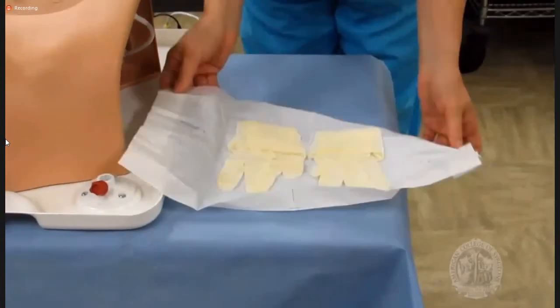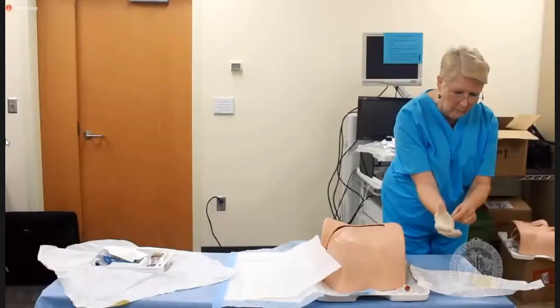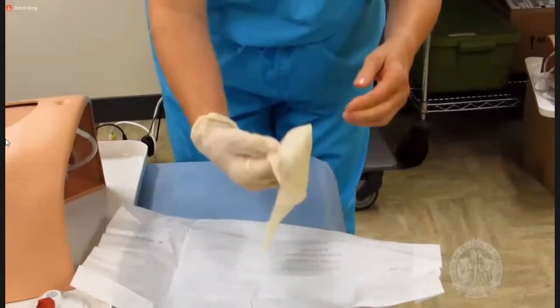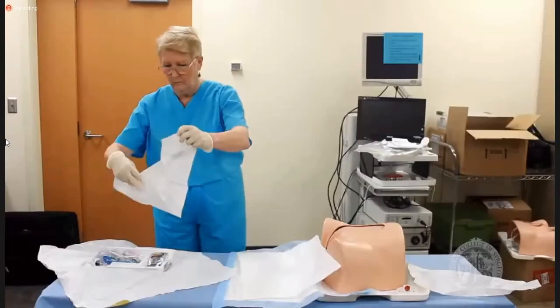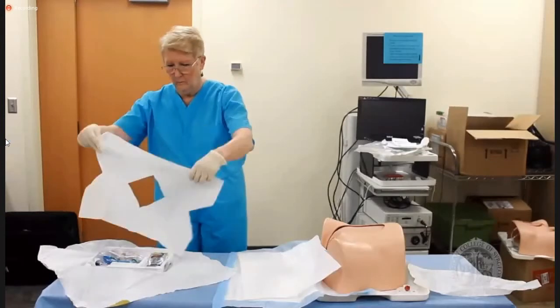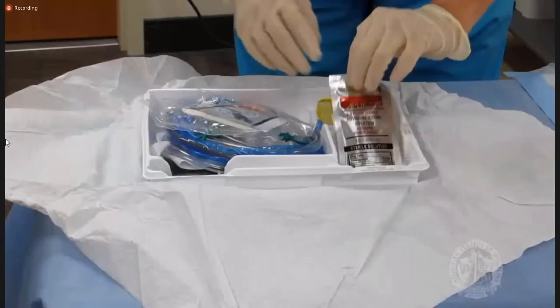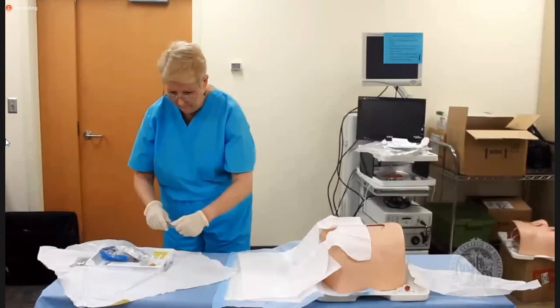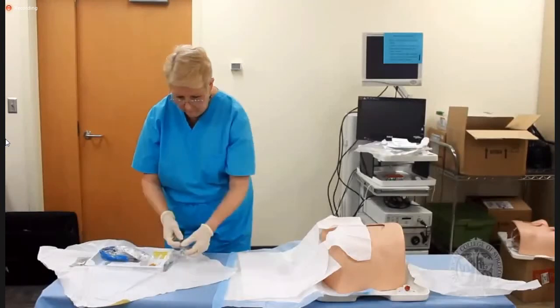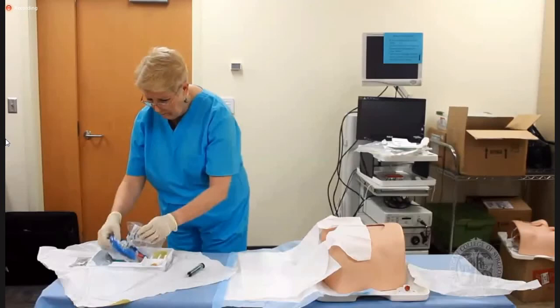Don your sterile gloves like so, making sure you have nothing below your elbows such as a watch or ring. Open the fenestrated drape and place it over the patient. Pour the iodine over the applicators and squirt the lubricant onto the sterile surface in front of the patient. 2% lidocaine jelly can also be injected directly into the lumen of the urethra with the syringe.